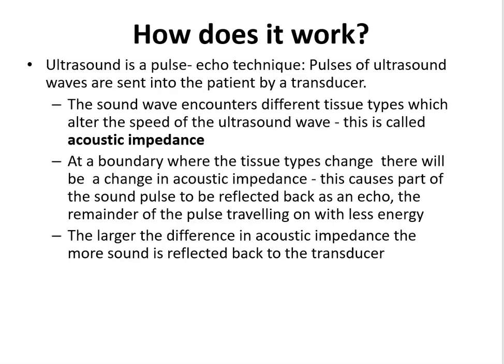And because we know the speed of sound, we can calculate the time it's taken for the sound wave to leave the transducer, hit the tissue boundary, and bounce back, and that will give us an indication of tissue depth, which then allows us to build a 2D image of different tissue structures. So what I'm going to do in this session is cover the theory behind how this works, to get to the point of being able to understand how ultrasound is used to image different structures.